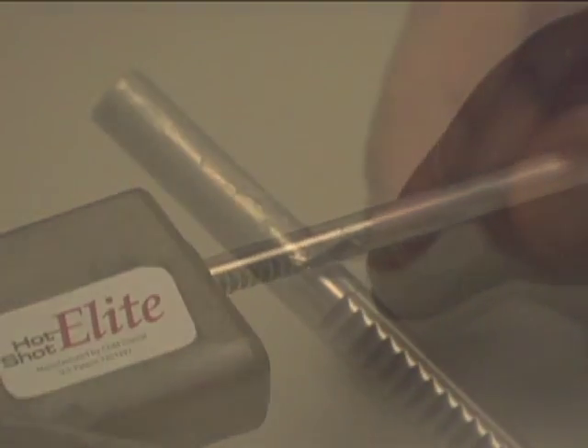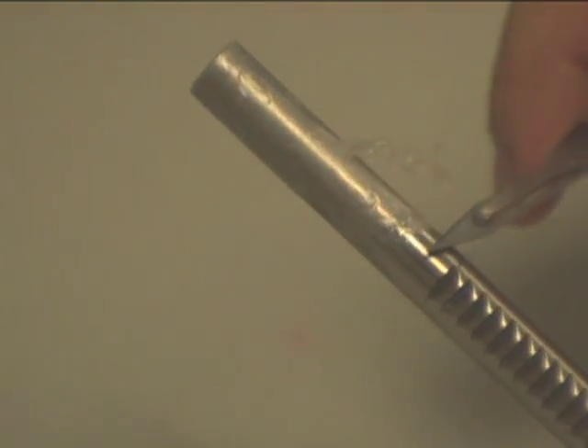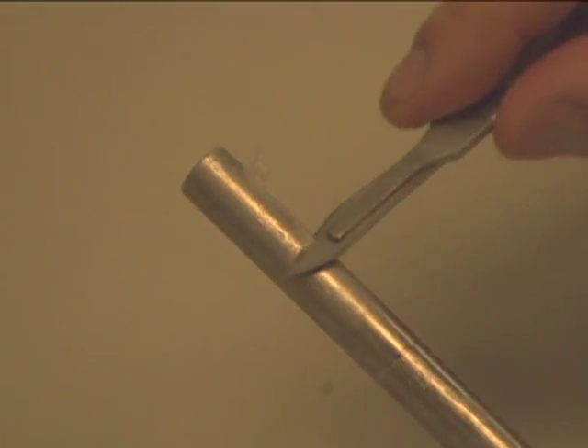Remove the rod from the gun immediately after injections. There will be a little material stuck on the rod once removed from the gun. When the rod cools, remove the excess material — it will come right off.